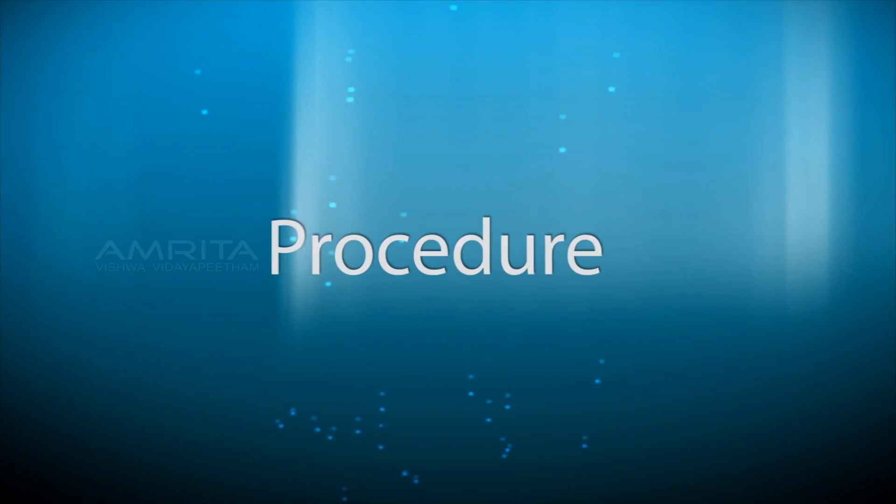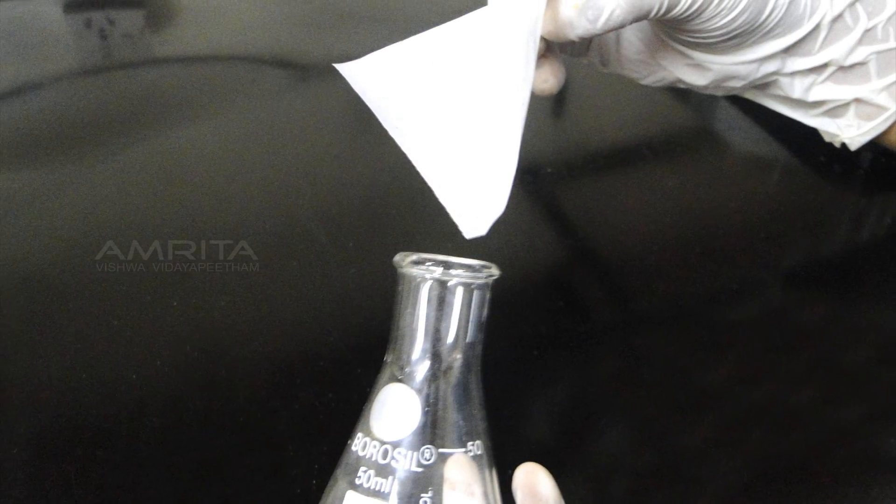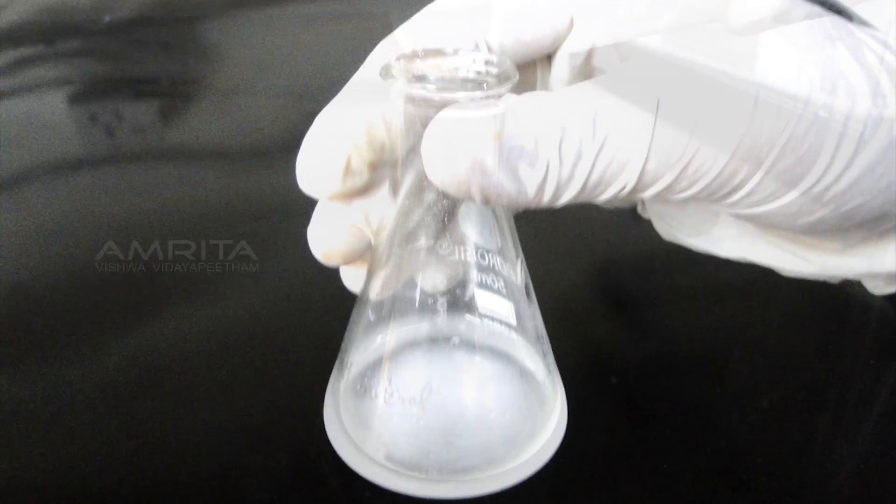Procedure: Boil to dissolve 0.1 g of agarose in 10 mL of 1x assay buffer. Cool to 55 degrees Celsius.